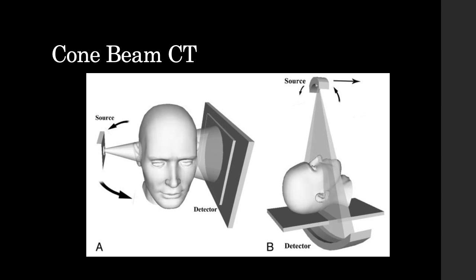I was reading a few papers, and actually people are going to start using this for chest CT next, which I think is quite good, particularly for people with COPD or infections that just can't hold their breath. It would be quite useful to have this sort of technology to get a really rapid diagnostic image of the chest. But obviously the chest is several times bigger than dental anatomy, so the loss of detail is the thing that's really holding that back at the moment. But hopefully as technology improves, that will improve.